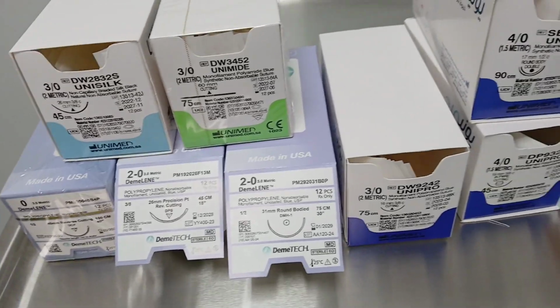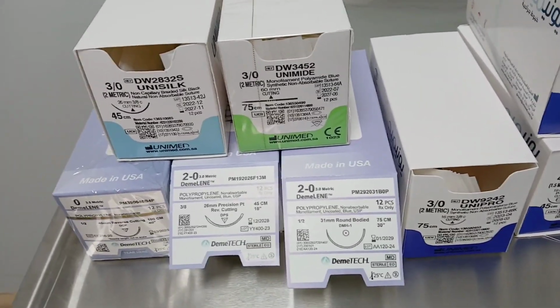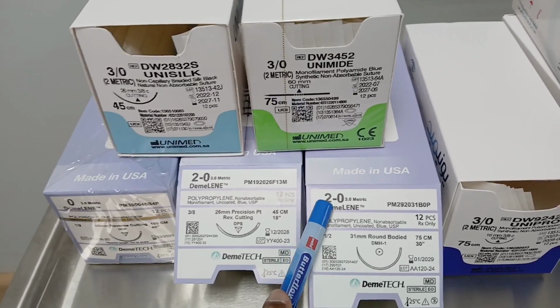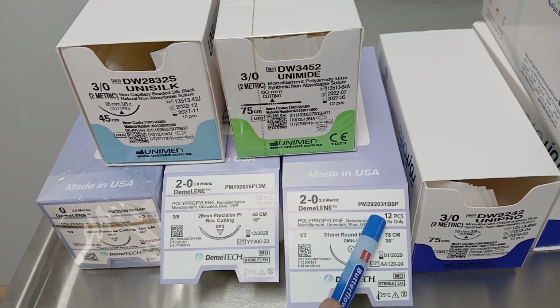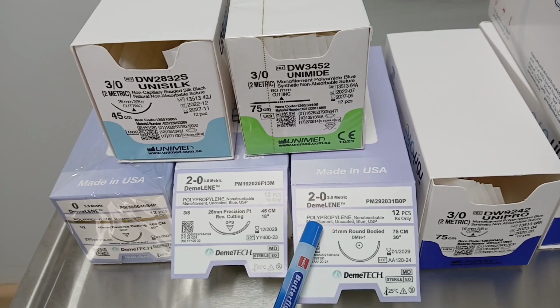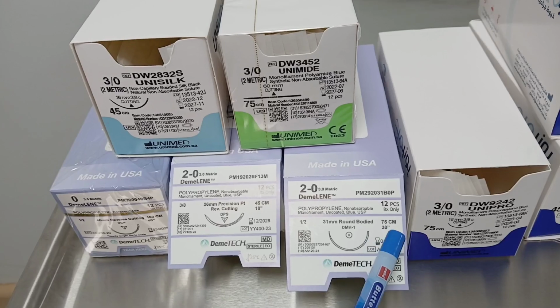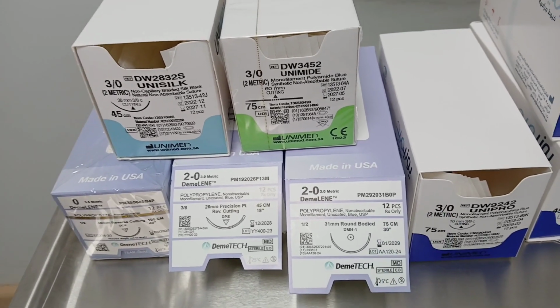So each suture box, before opening, we have to check: first the number, then what type of suture material, absorbable or non-absorbable, monofilament or multifilament, and how much length of the suture material.